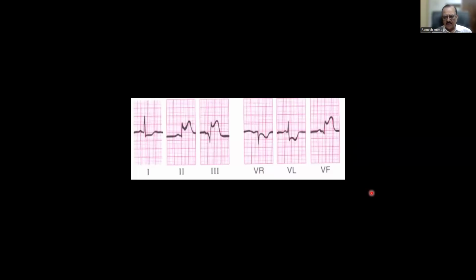Do you think it is a red thrombus or a white thrombus? I told you in the class, in the pathophysiology of coronary disease. Do you think the occlusion has led to a red thrombus or a white thrombus? ST elevation is a red thrombus. ST depression is a white thrombus. So what will you give? Antiplatelet or fibrinolytic therapy? Fibrinolytic. Yes, this patient requires fibrinolytic therapy. Super. Excellent.